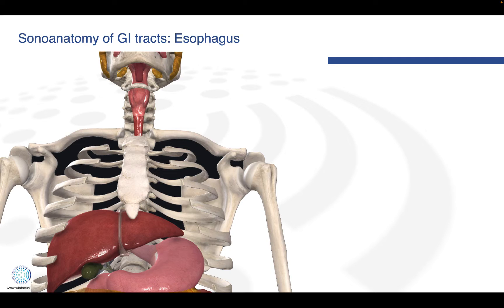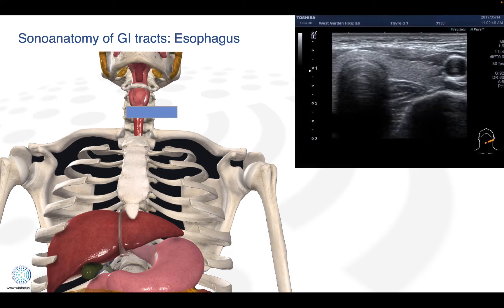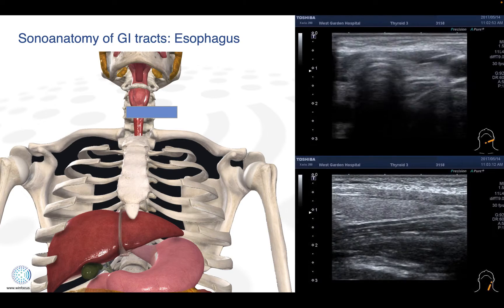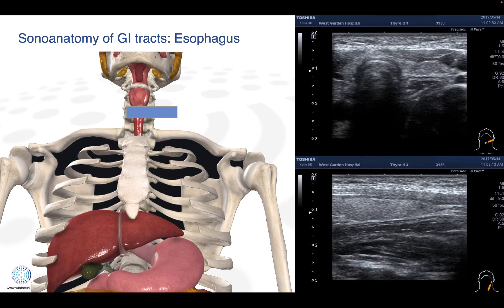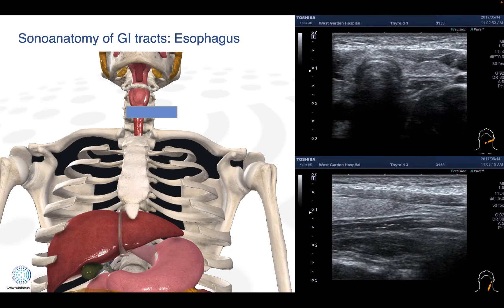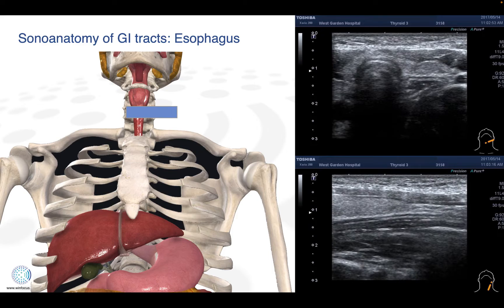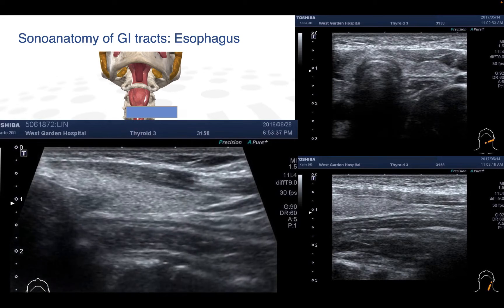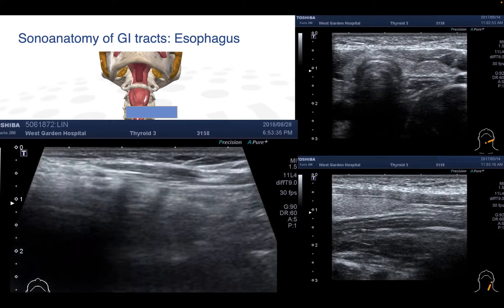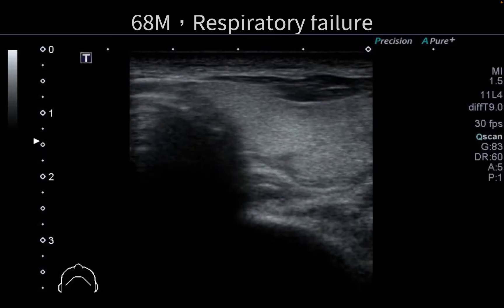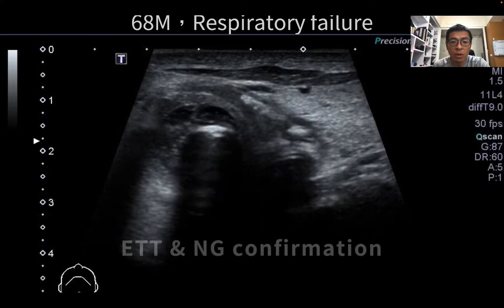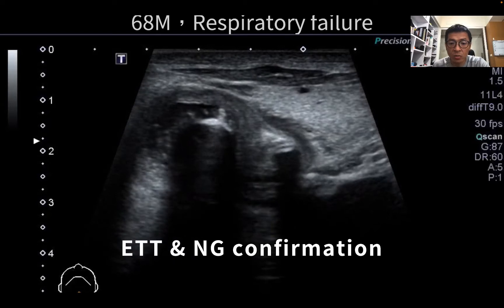We start from the first GI tract to observe the cervical esophagus. It's superficial, so we use a linear transducer. We can see the cervical esophagus next to the trachea. First, we scan longitudinally and can see the tubular structures of the esophagus. It is also possible to observe some movement, like swallowing. We scan this part to confirm procedures over the neck, like ET tube intubation and NG tube intubation.